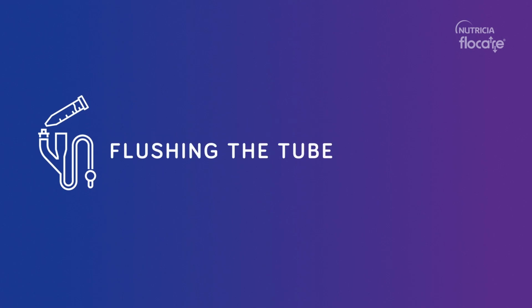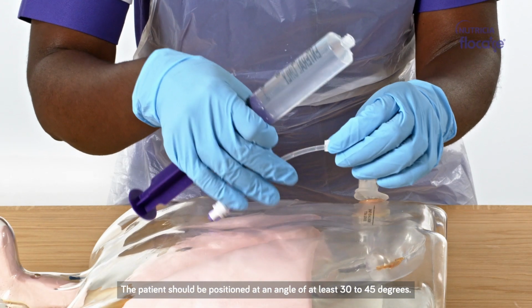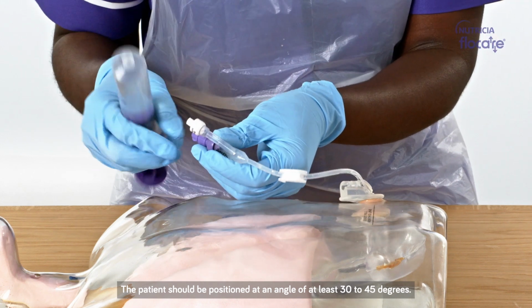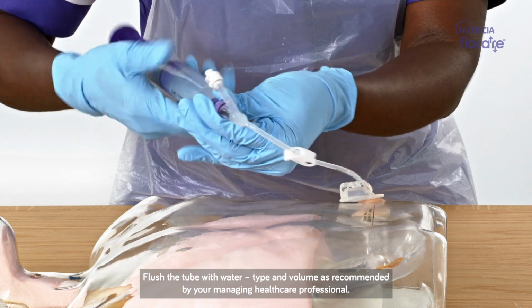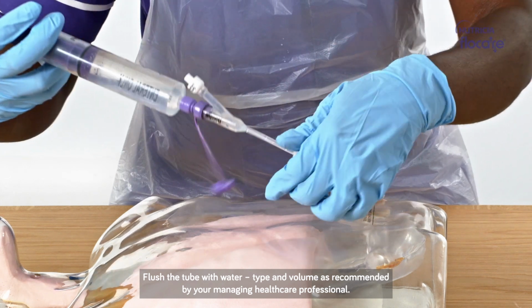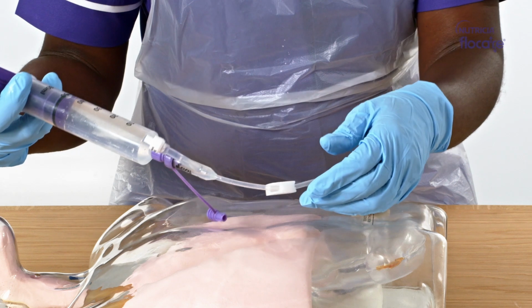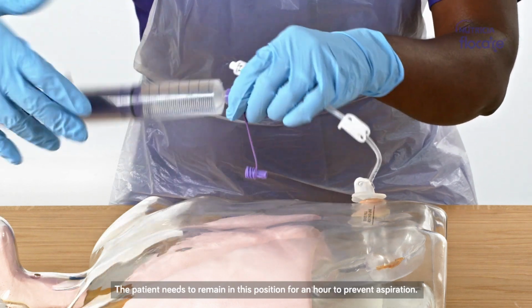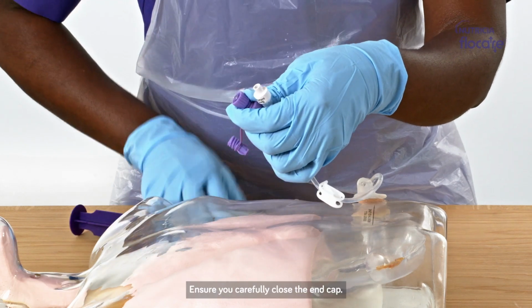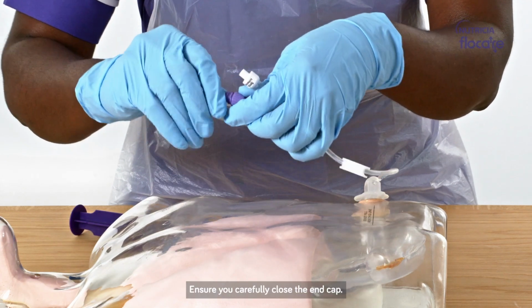Flushing the tube. The patient should be positioned at an angle of at least 30 to 45 degrees. Flush the tube with water, type and volume as recommended by your managing healthcare professional. The patient needs to remain in this position for an hour to prevent aspiration. Ensure you carefully close the end cap.